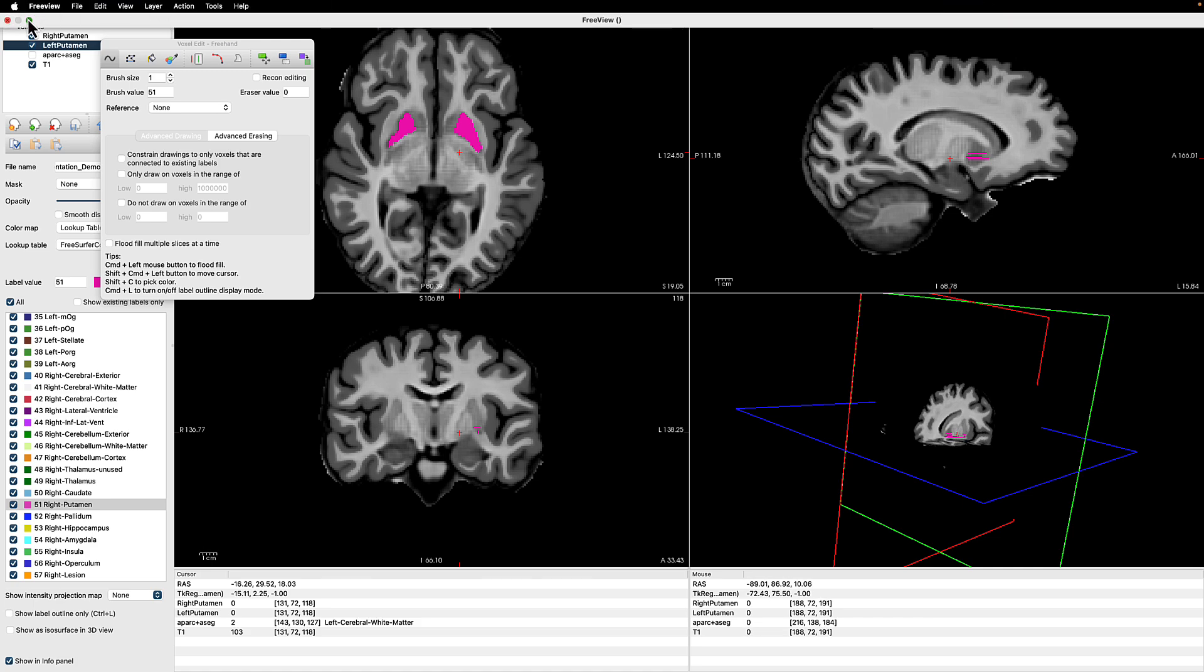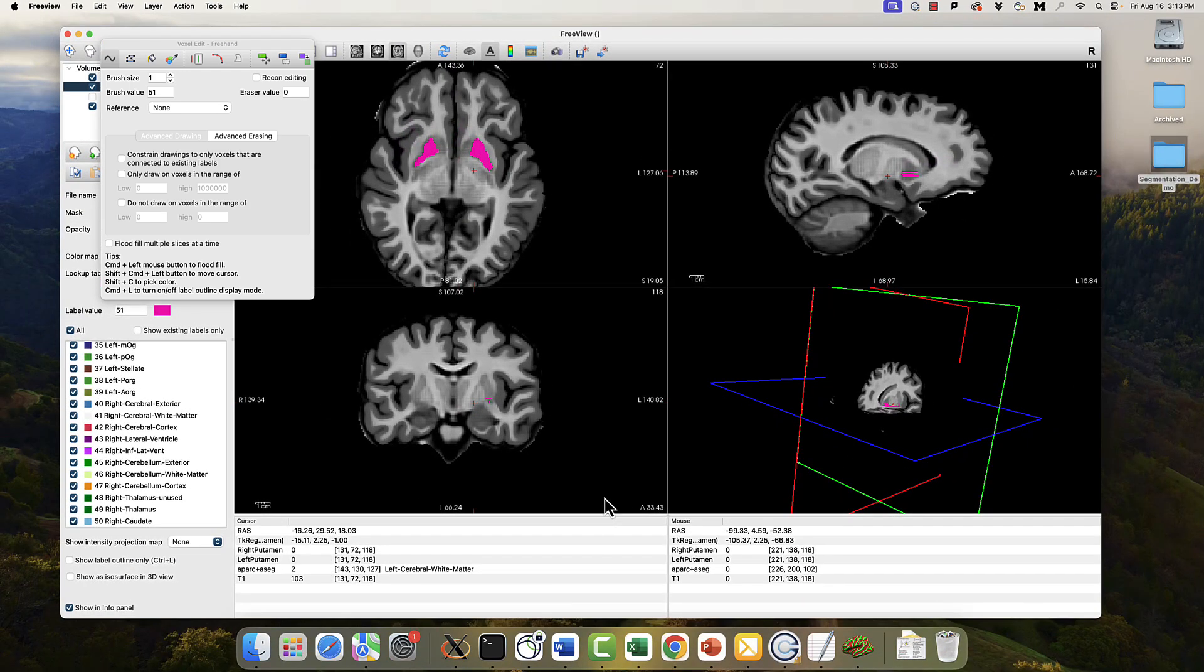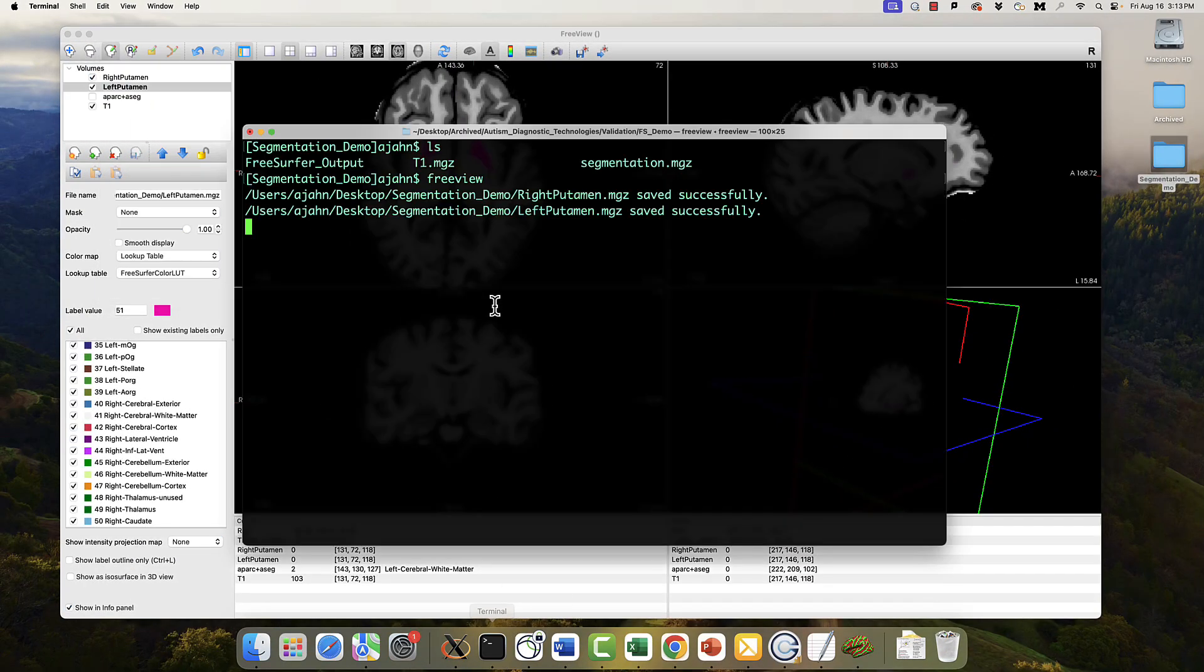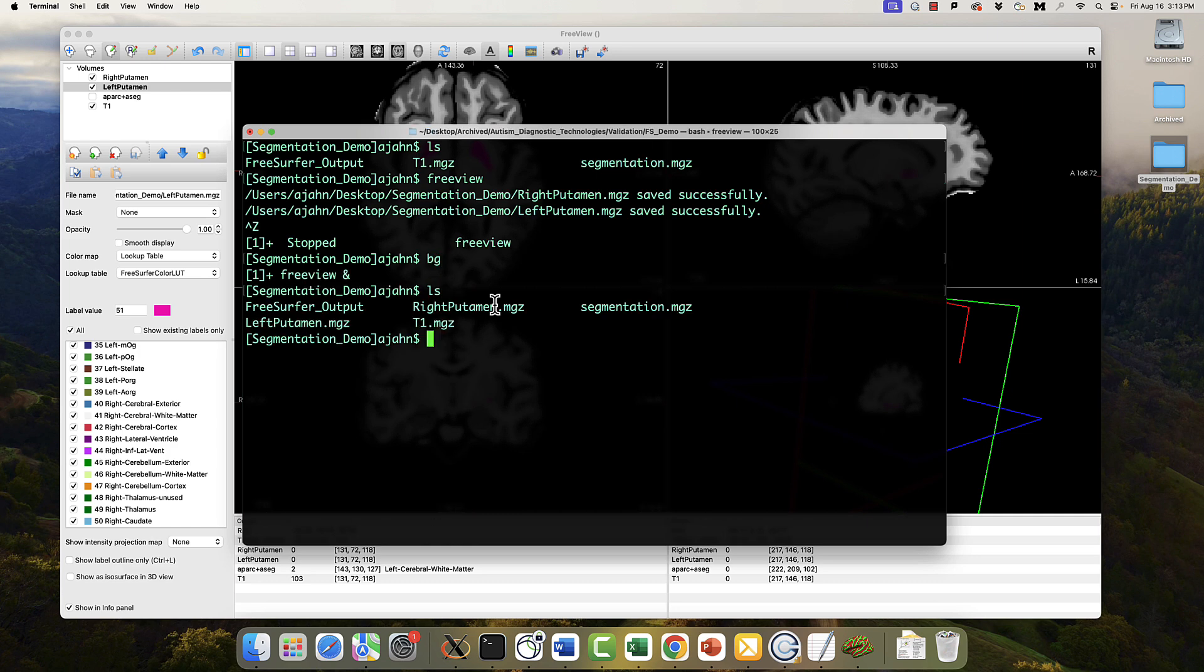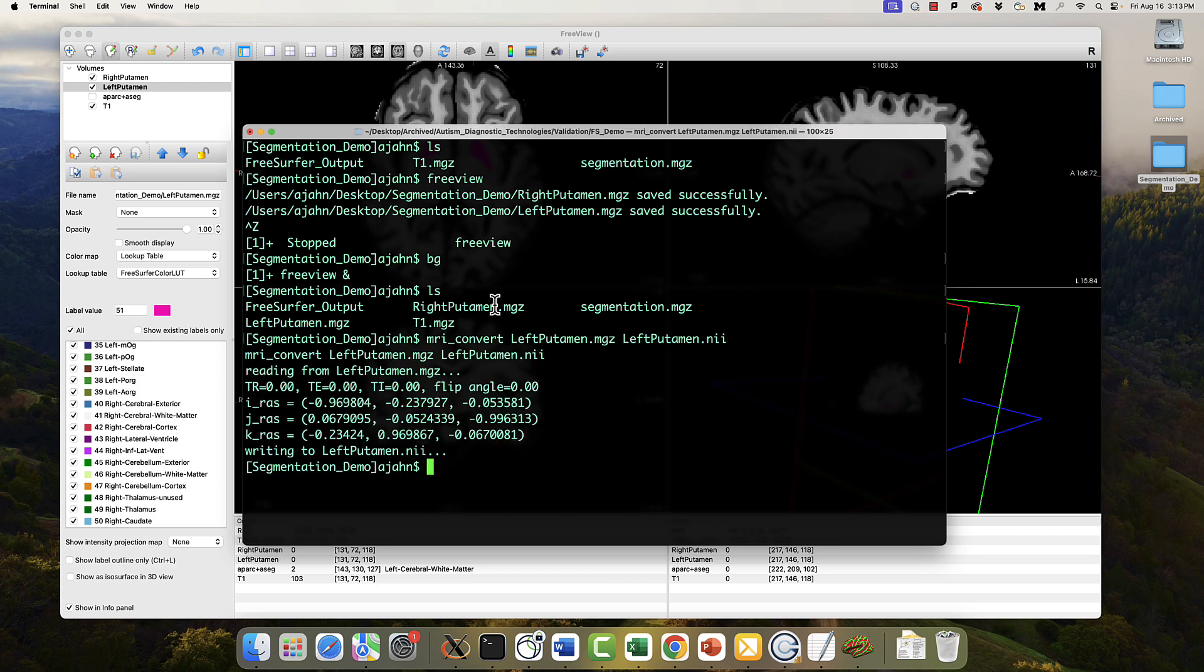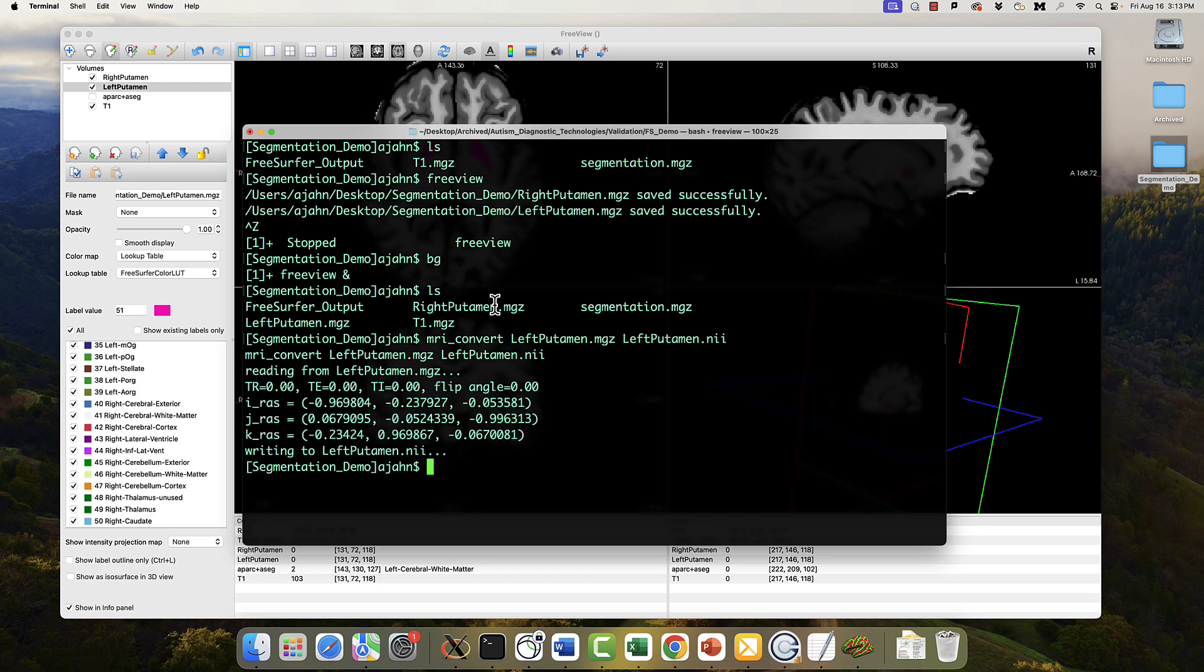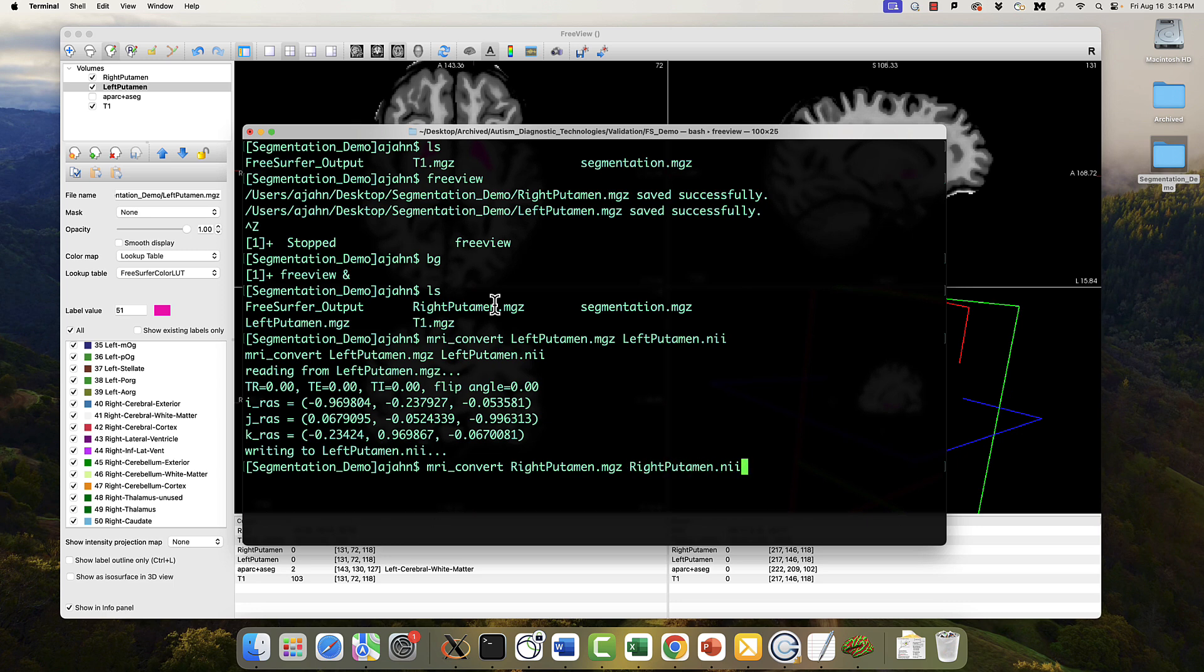I'm going to go back to my terminal briefly and illustrate how to combine these two. So I clicked Ctrl Z, then BG to run both the terminal and FreeView at the same time. If I want to convert these into something like nifty format, I can use MRI convert, followed by the name of the structure I want to convert, and then the output, in this case left putamen.nii. I can do the same thing for the right putamen, and then use any image calculator I want to combine the two.